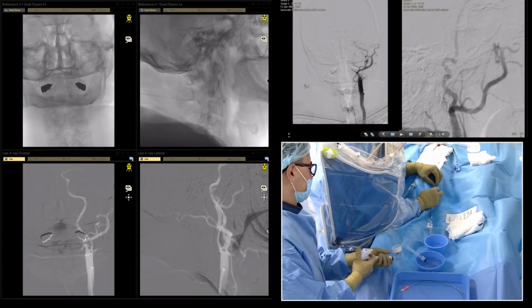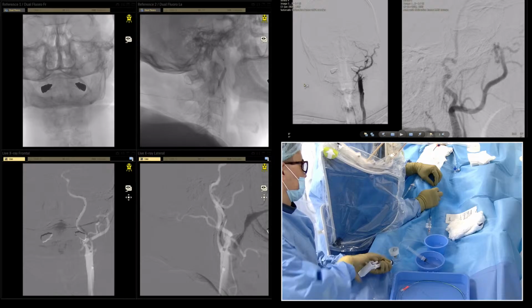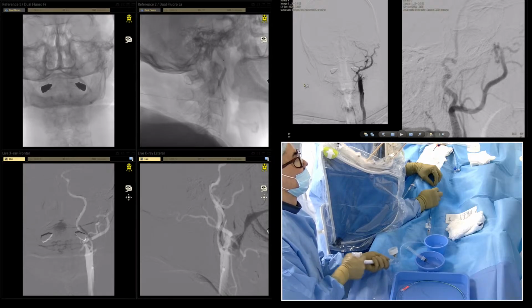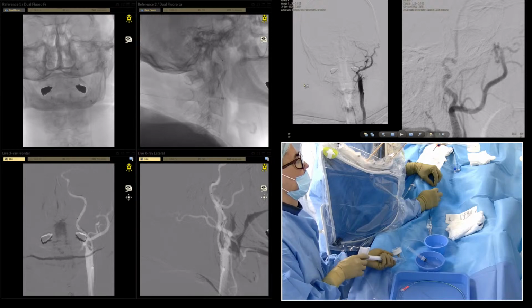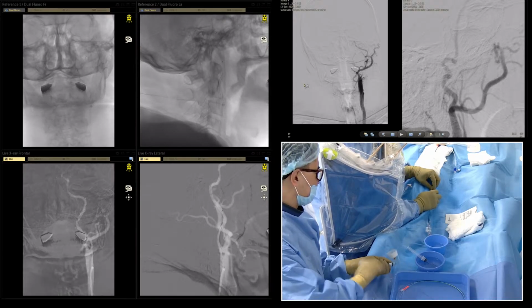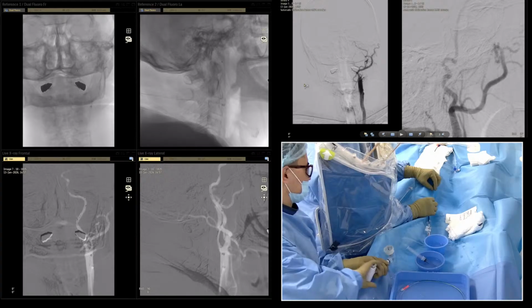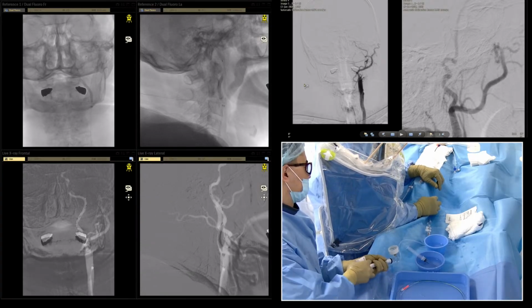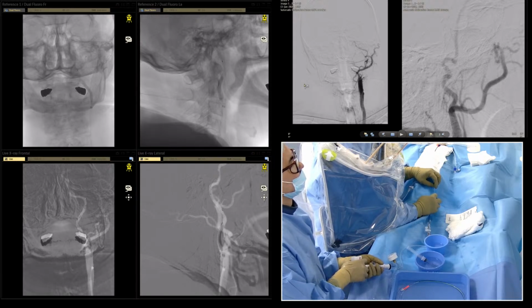Once again, we'll give 20 atmospheres. On 20 it will be 3.66 millimeter. Stop there. It's quite a stiff plug.